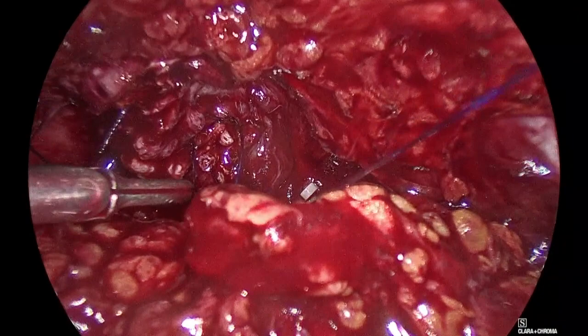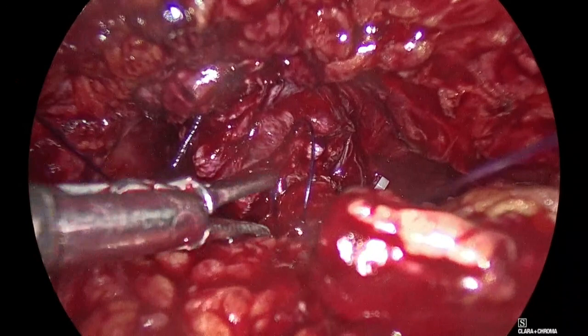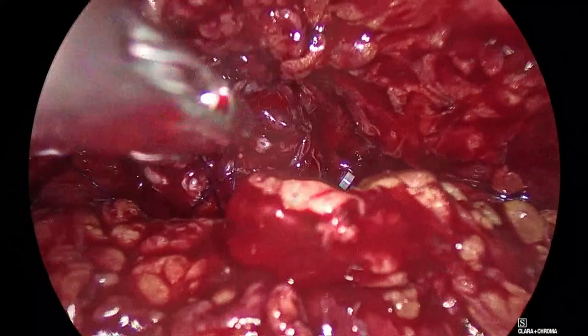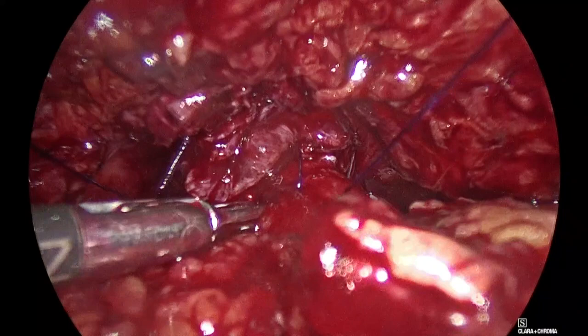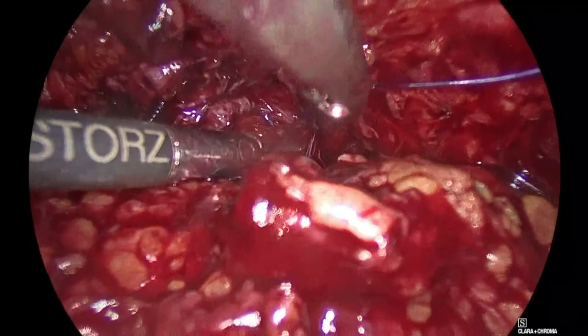Padeli, to the left a bit. To the left, Padeli. There, not so much. See that this needs to tighten a bit, because if I pull only on one, it will not come out nicely. We need to remember that the anastomosis is 6 o'clock. Everything is the bottom part of the anastomosis, the posterior layer. If the posterior layer is good, everything is perfect.